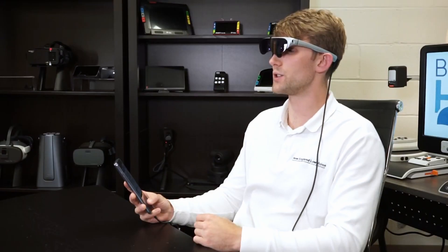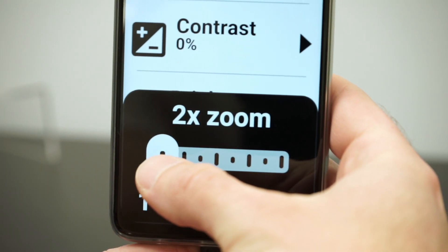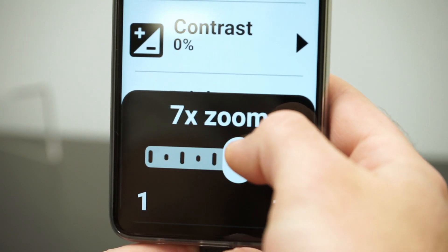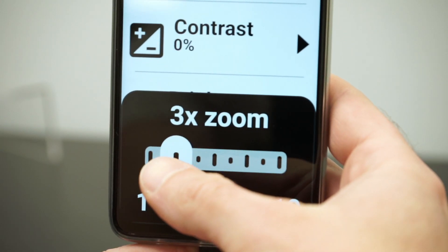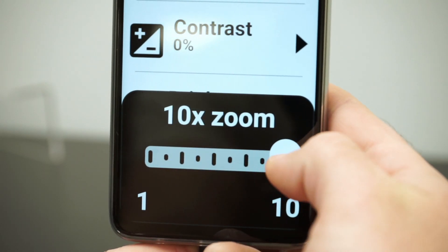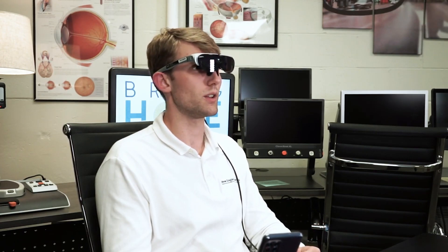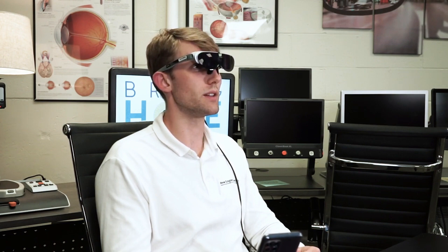When I see something in the distance that I want to magnify, I just scroll here on the app and it will zoom in one notch at a time. This device goes up to 10x, so it really gets up there in the magnification so we can really zone in on what we want to see.